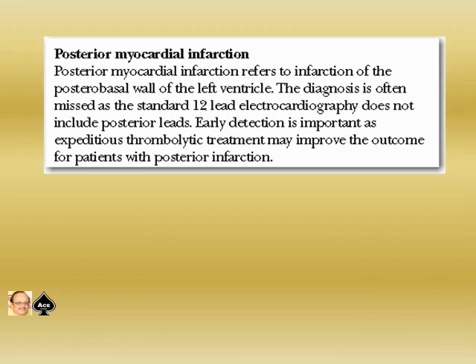So one thing I told in the beginning was the right ventricle, and the second thing I am telling here is the posterior infarction. These two are likely to be missed, especially if you are in an emergency setup and early morning 4 o'clock to 8 o'clock. The duty doctor also may be on the verge of going home, so ECG reading may be missed, so please take care.